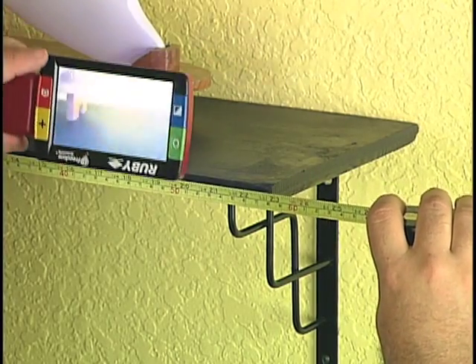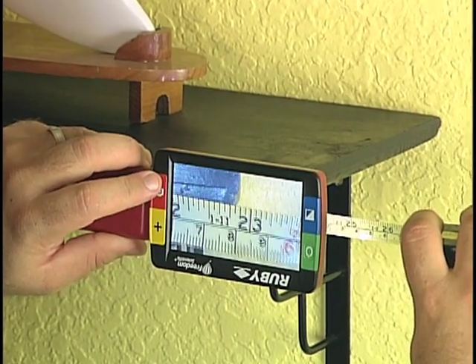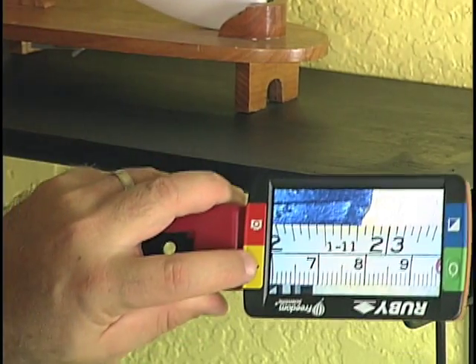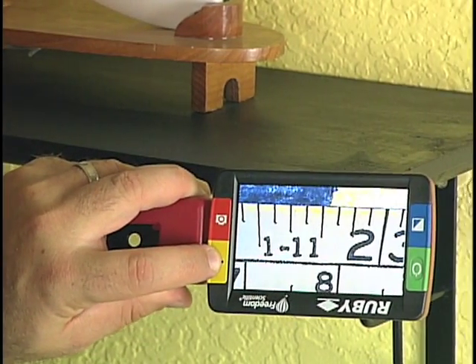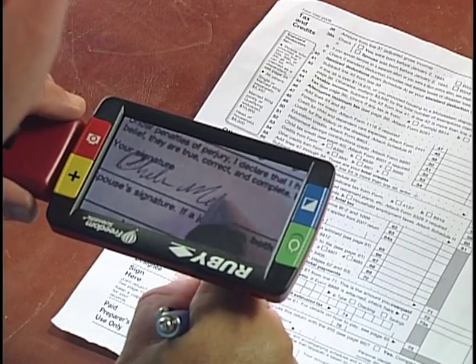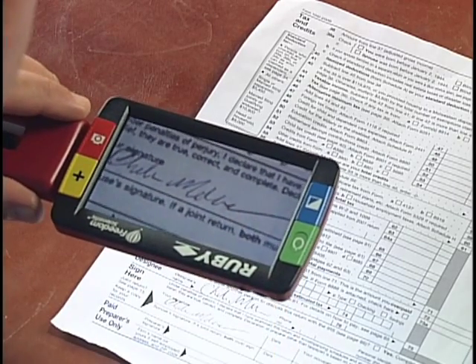The freeze frame feature lets me capture what I need to read and even zoom in to be absolutely sure. The Ruby's focus stays nice and crisp, even when I'm several inches off the paper.